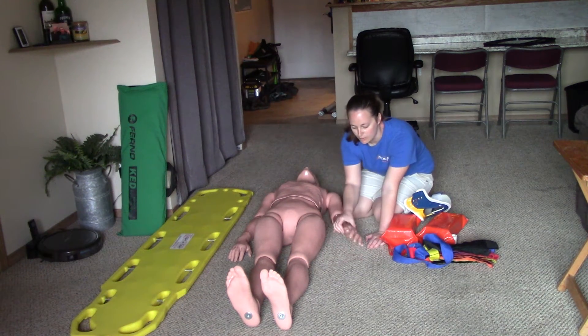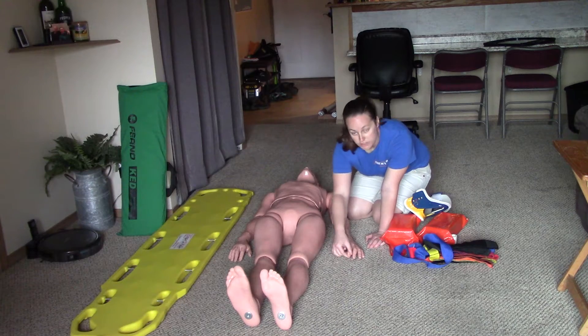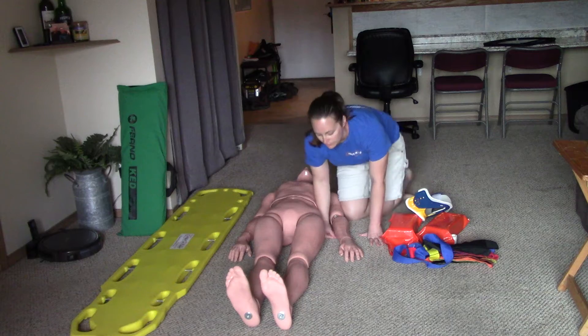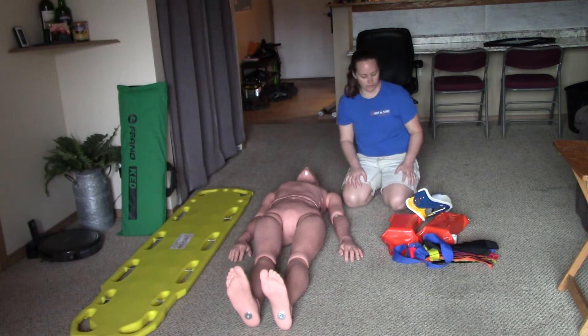I'm going to check CSMs — checking for a pulse. Please squeeze my hand. I'll repeat that in all four extremities. You can verbalize it just that way: say you'll repeat it in all four extremities.